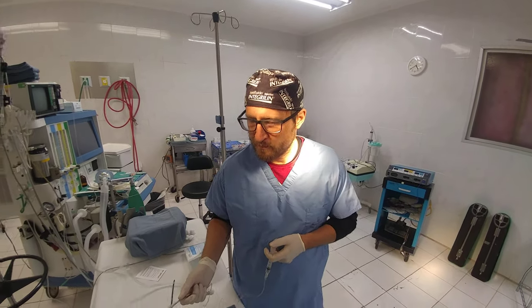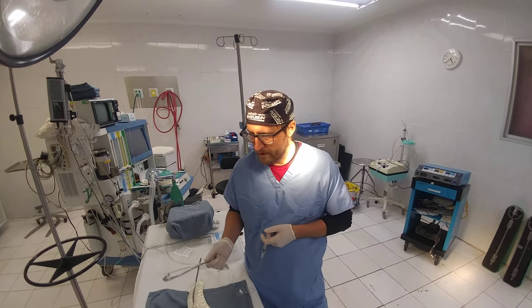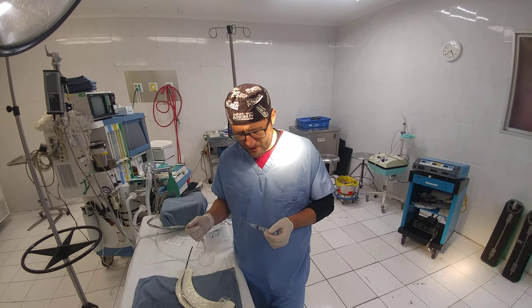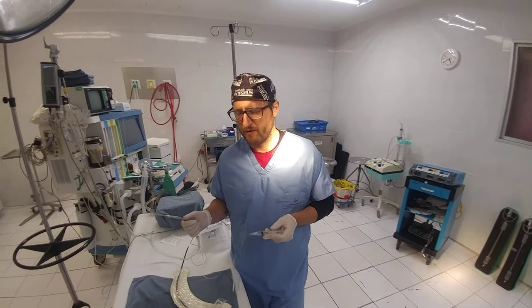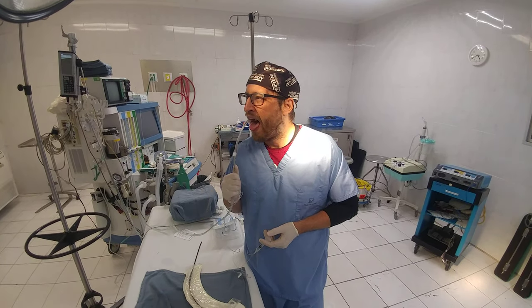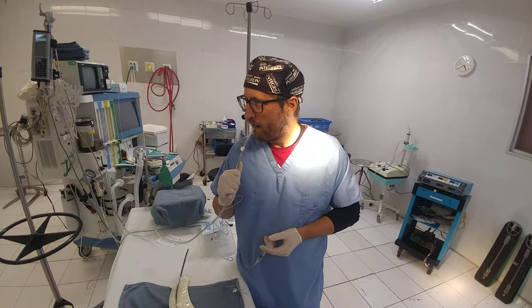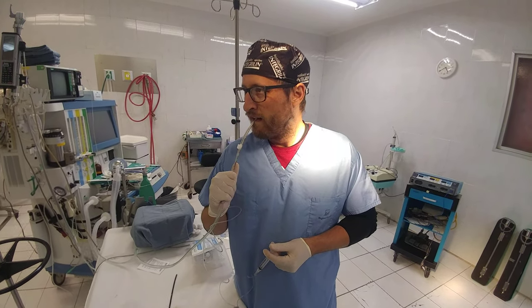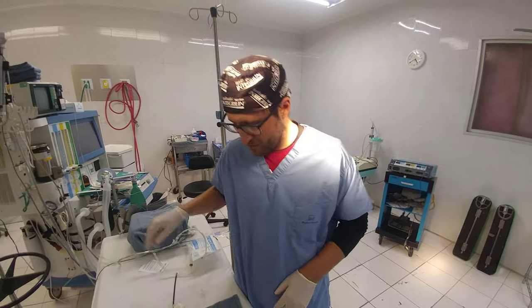Give it a little bit of a break in between. Let it work up. I've used about 3.5 cc so far of 5% lidocaine. That's it for topicalization.